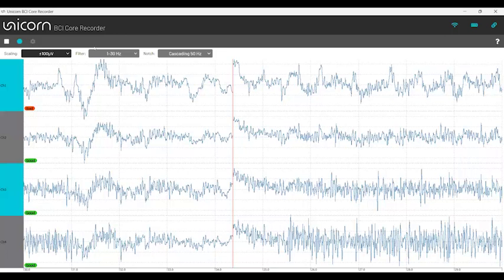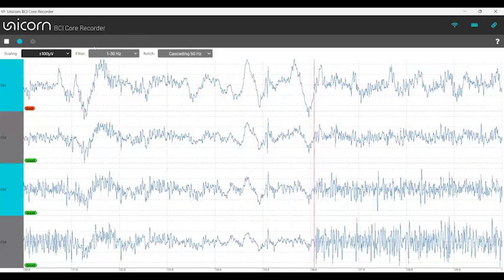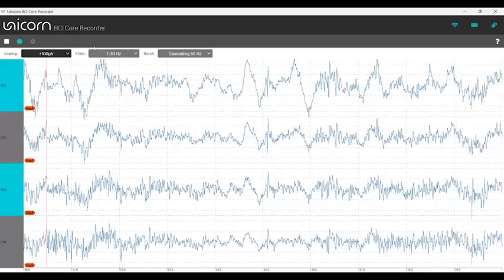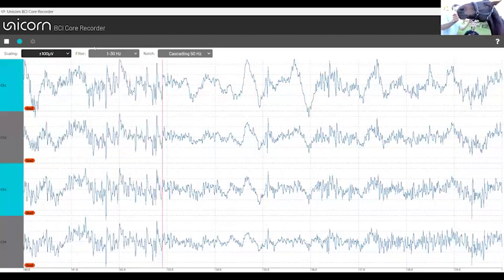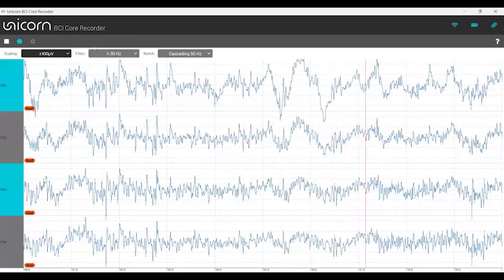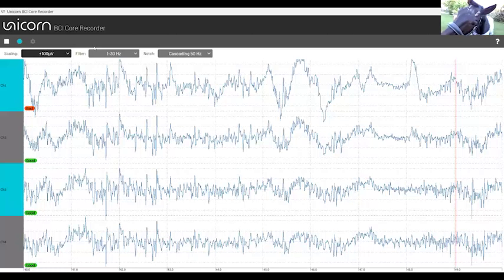And that can be explained by the distance from the grounding electrode to the other electrodes. So maybe, Leo, you can show again where the ground is located. Exactly. So the ground is actually behind you here on the left side. So the distance is like 20 centimeters.